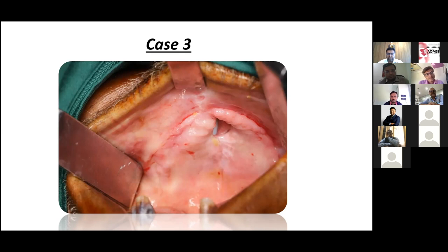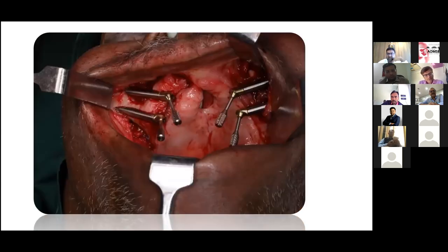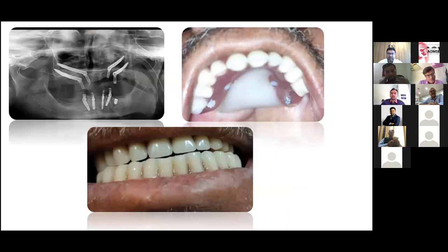Because there was lots of fibrosis. In this case, before doing the surgery, we initially tried to close the defect with the facial artery flap, but it didn't work. And this is the case we are seeing after the failure of the facial artery flap. We had lots of fibrosis even after that failure. So we did quad zygoma and used the prosthesis directly to close the defect, so that at least it doesn't give any regurgitation of fluid to the patient.